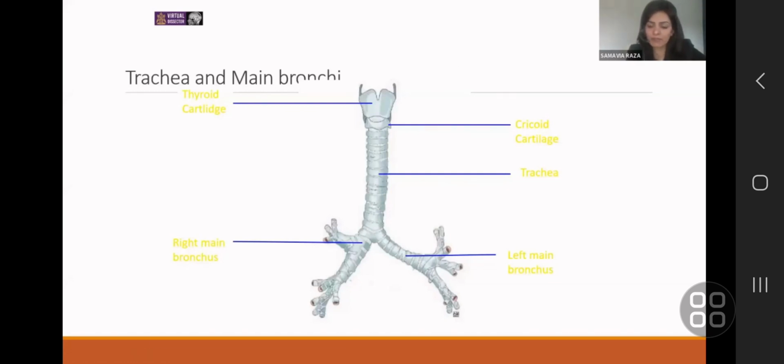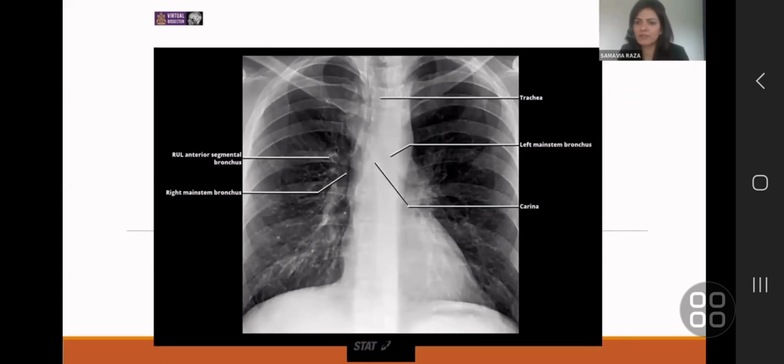The next bit I get asked very commonly is the dimensions, the absolute centimeter or millimeter sizes of the trachea. Again, huge variation. The only difference in literature or in textbook is in gender. So clearly men's trachea or airways are bigger than the females, but that is assuming an average size man compared to an average size woman. It is entirely possible for a small stature man's airways to be smaller than a tall, broad female's trachea, and that is entirely normal. So don't, like I said, don't focus on the absolutes.